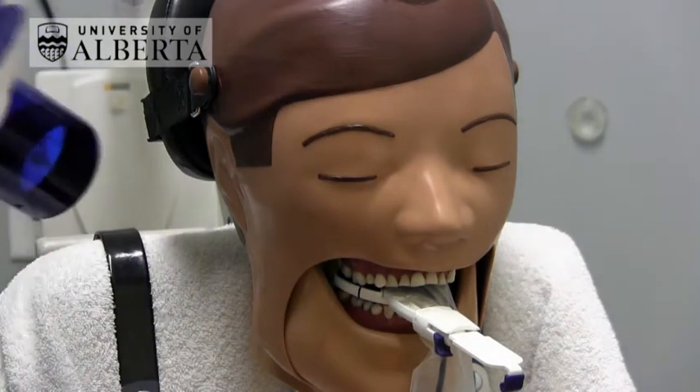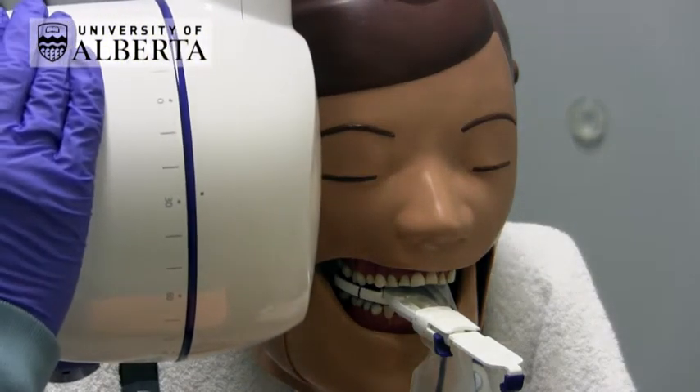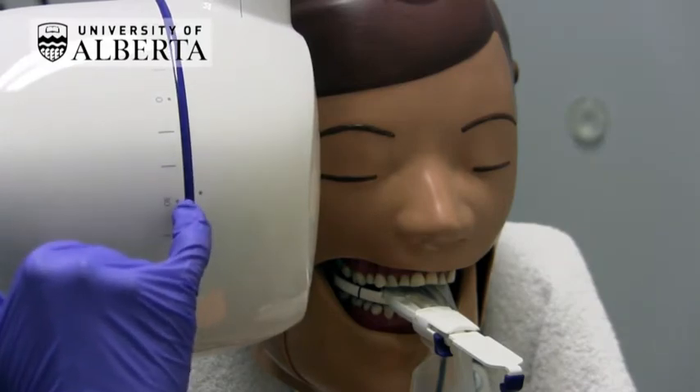When aligning the BID for a maxillary premolar or molar periapical, I usually use an angulation of between plus 20 and plus 30 degrees.